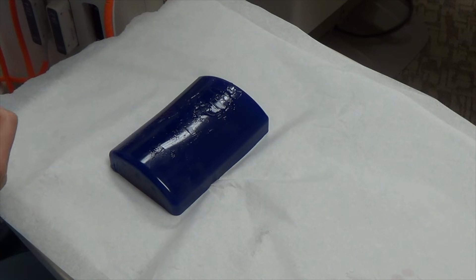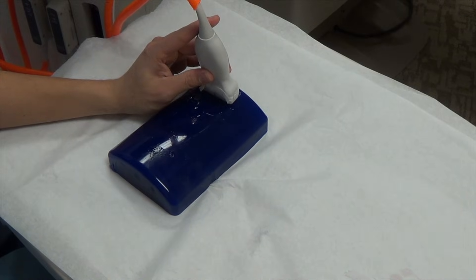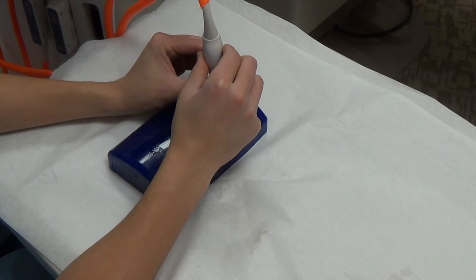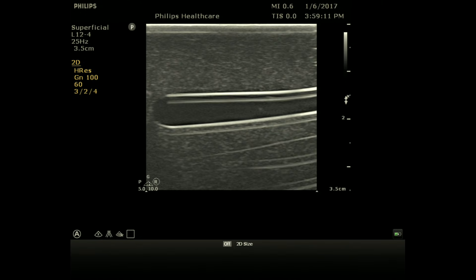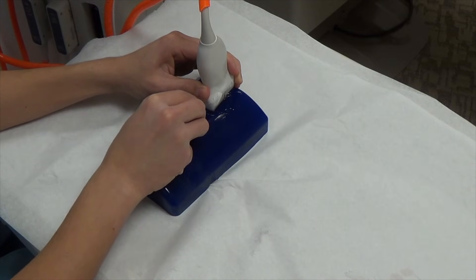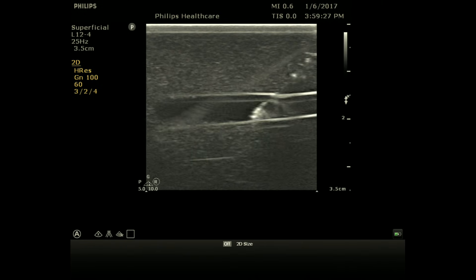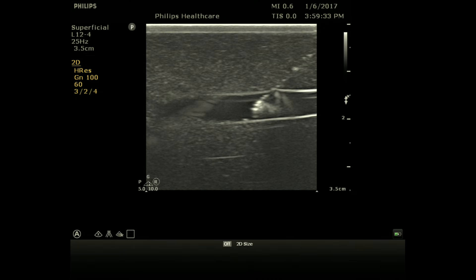We've now shown the short-axis approach; next is the long-axis approach. Start with a short axis to identify your vein and center it on screen. Using two hands, while keeping the vein centered, rotate the probe clockwise to get a long axis of that vein. Keep your left hand very still, then advance the needle — you'll see it entering from the right side of the screen as it enters the vessel. Be careful not to go through the posterior wall; you want the needle tip right in the middle of the vessel before threading the catheter in.